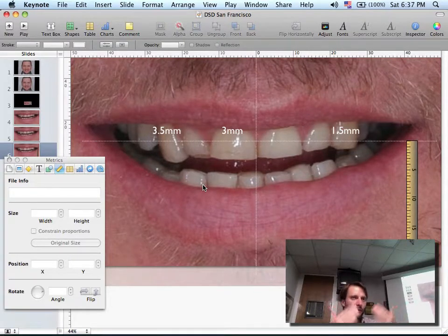Then the fourth step is the lingual of the lowers. Now that I have the position of the buccal and incisal edge in the curve, I can see how thick they are, and I can plan if I have to prep the incisal edge or not to make them more delicate. So the wax up moves and starts guiding us on that. Then I finish the lingual of the lowers. So I now have 6 uppers and lowers, buccal and lingual.